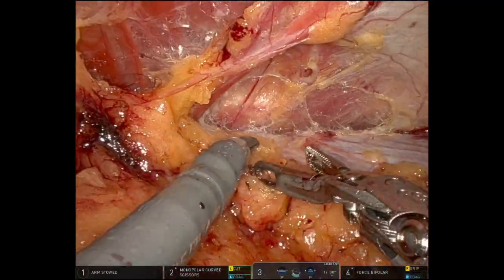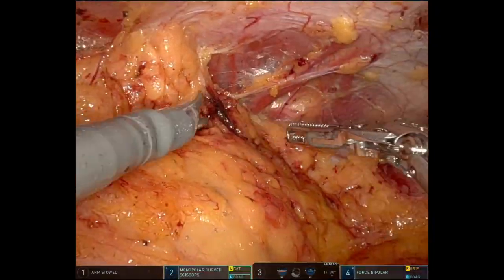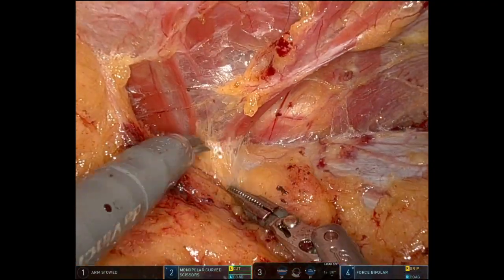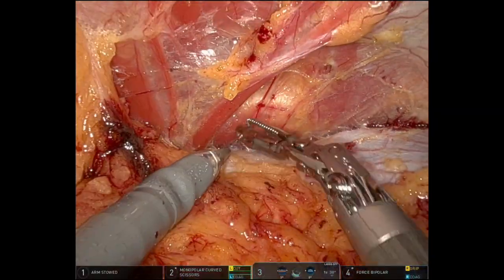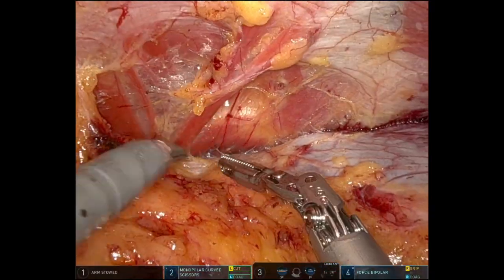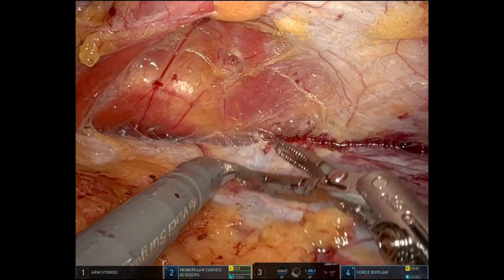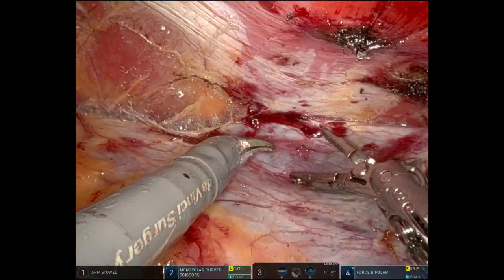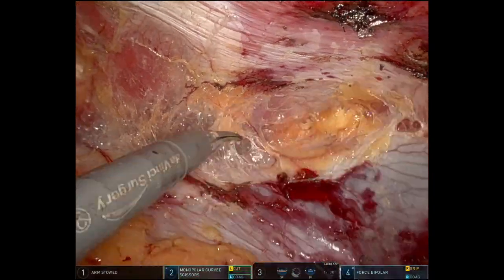I've seen a band of diaphragmatic fibers coming off from the transverse abdominis, which I haven't seen before — I'll show it again later. I'm dissecting this space all the way; that's the costal margin, and you can see those fibers of the diaphragm coming off from the transverse abdominis muscle. I'm continuing to develop that space, going laterally and caudally, dropping the transversalis fascia down.